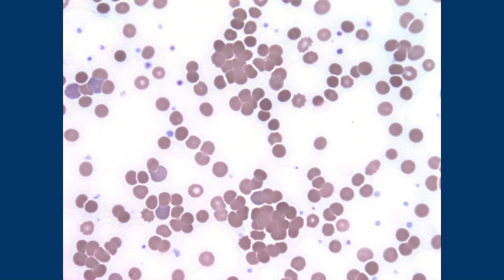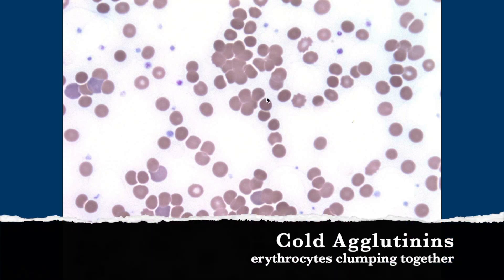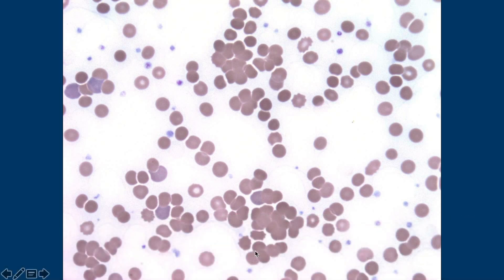So these are cold agglutinins because the red cells are agglutinating. My lab has a warming procedure — they'll give me this slide pre-warmed and post-warmed, and you would expect to see the agglutination resolve, or mostly resolve, with the warm specimen. Then you feel pretty good that this is probably cold agglutinin.